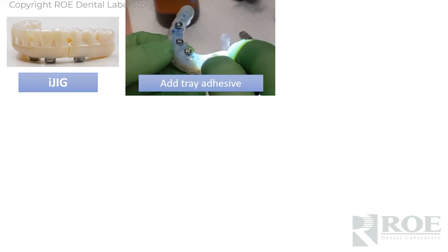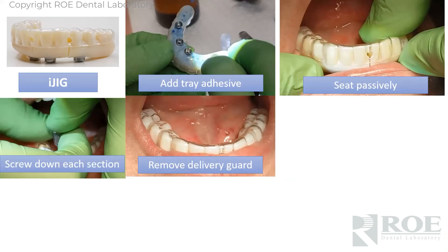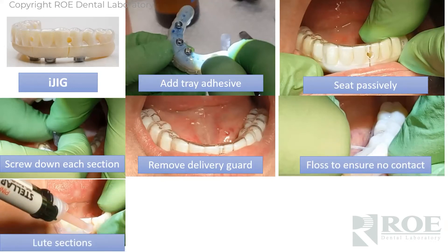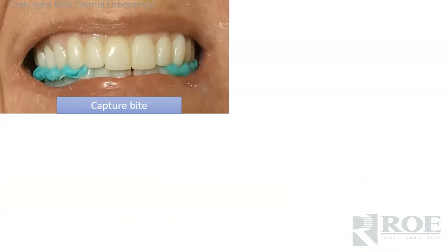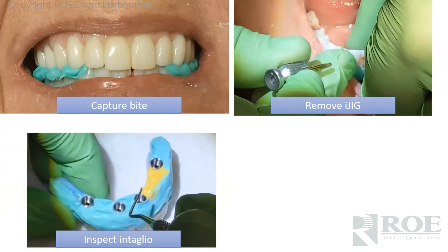Here's the process quickly: the iJig comes to the mouth, put some tray adhesive on the intaglio, seat it, and screw it down. There's a delivery device — a tray in the top right that delivers it. Remove the tray, run floss through each section, then inject. We use Stellar; you can use Voco or Duralay — near-zero shrinkage factor is very important. Cure it if it's dual or light cure, fully equilibrate, capture a bite, remove the iJig, and inspect the intaglio to ensure the reline impression is intact.